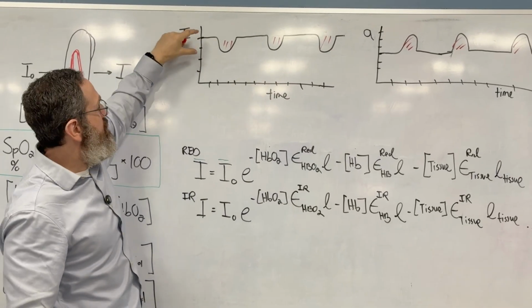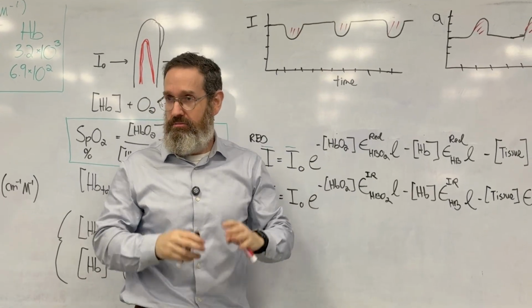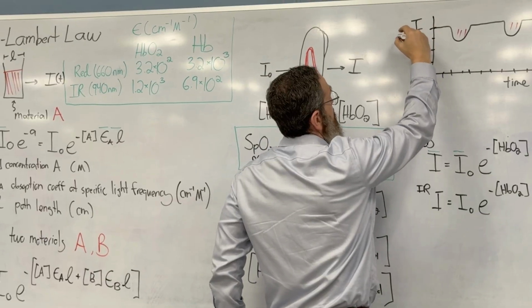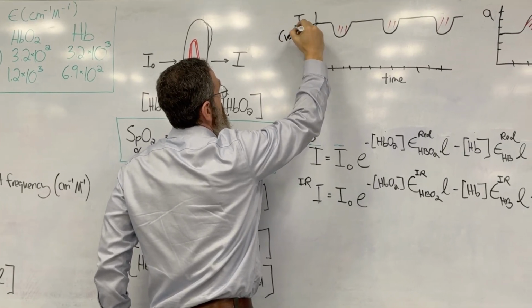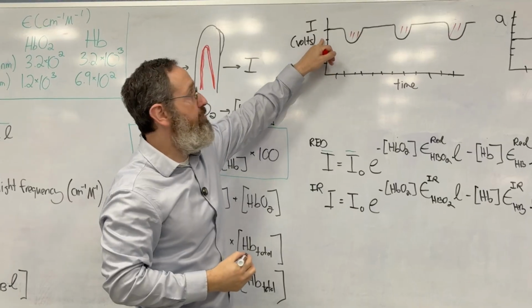And so what I want to do is extract just this part that's changing. Now, if it's coming out of the sensor, I'm going to write this in units of, I know it's intensity, but I've converted it to volts. I think it's easier for you to realize. It's like 1 volt, 2 volt, 3 volt, 4 volt.